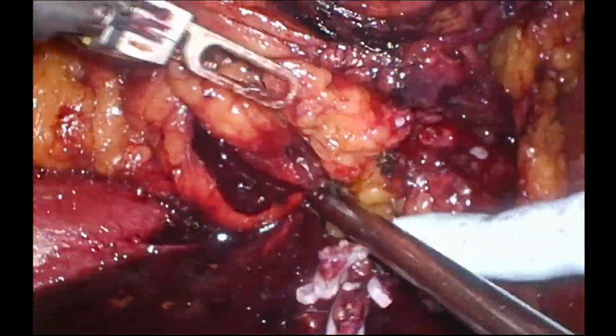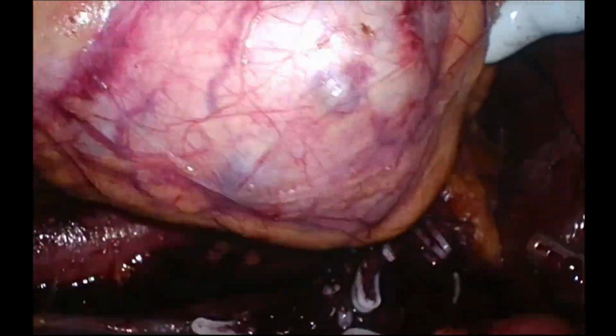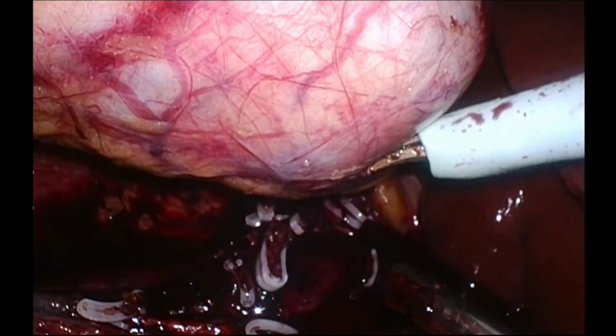After renal hilar control, the kidney is devoid of its both arterial supply and venous drainage. Rest is perinephric dissection outside the Gerota fascia.